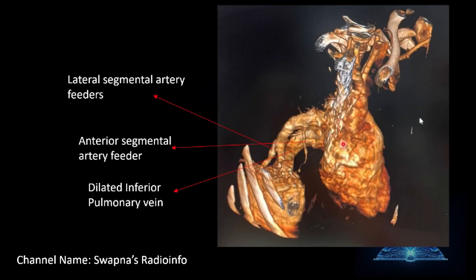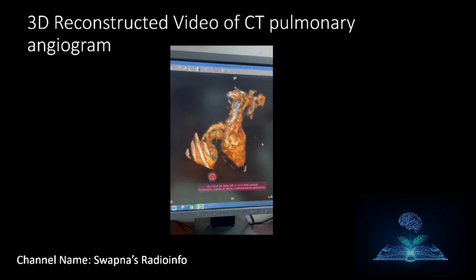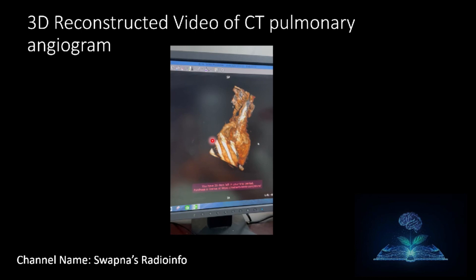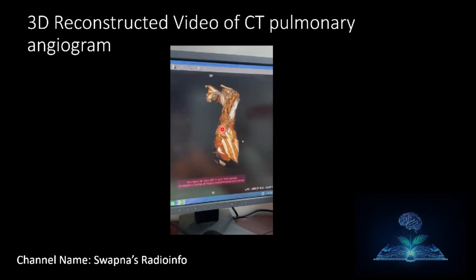This is a 3D reconstructed image. You can see two arterial feeders from the lateral segmental artery and one from the anterior segmental artery. The dilated inferior pulmonary vein and the vascular nidus are clearly visible. The 3D reconstructed video of the CT pulmonary angiogram similarly demonstrates the arterial feeders, dilated inferior pulmonary vein, and vascular nidus.